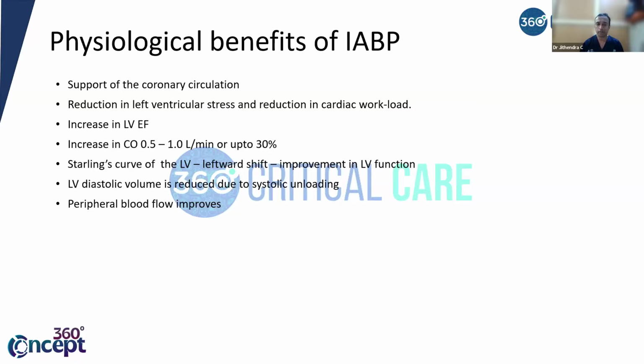Again, this may or may not be asked in your CBS. CBS, it can be part of your question on what are the physiological benefits. Sometimes they can ask you in the CCS also. So you started your patient on IABP, they may ask you about the physiological benefits. So what are the benefits of IABP?